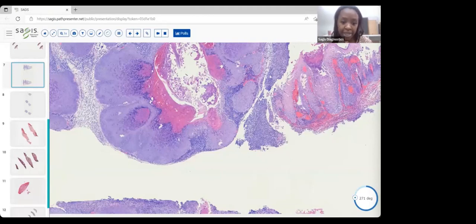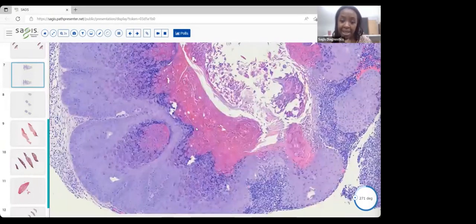But we did point out with the myrmecial wart that, and again, this is the differential because it can look so similar, the keratinocytes varied quite a bit in size and shape. Whereas with the molluscum and the inclusions in the molluscum that is infecting these keratinocytes, these are all keratinocytes, right?